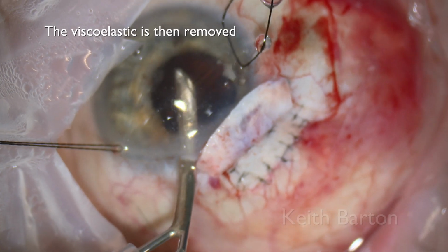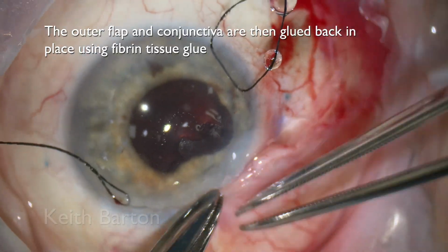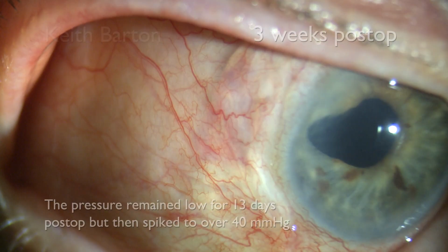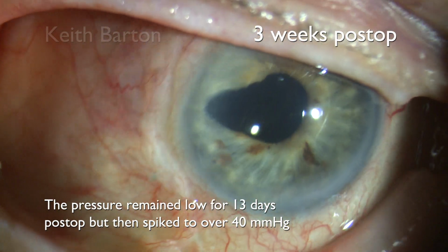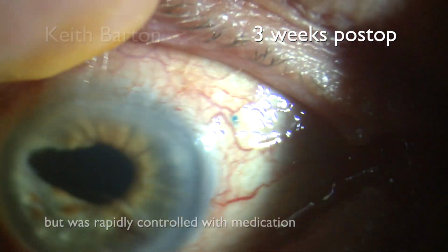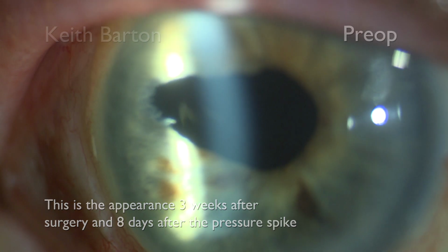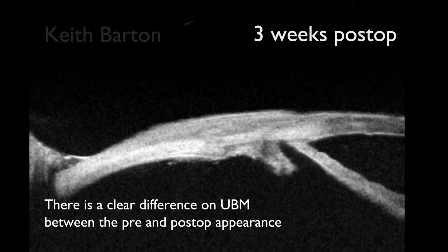The viscoelastic is then removed. The outer flap and conjunctiva are then glued back in place using fibrin tissue glue. I also place 1 or 2 sutures in the conjunctiva if required. This is the appearance 3 weeks after surgery. The pressure remained low for the first 13 days, but then spiked to over 40 millimeters of mercury. But this was rapidly controlled with medication. And this is the appearance 3 weeks after surgery and 8 days after the pressure spike. There's a clear difference on UBM between the pre- and post-operative appearances.